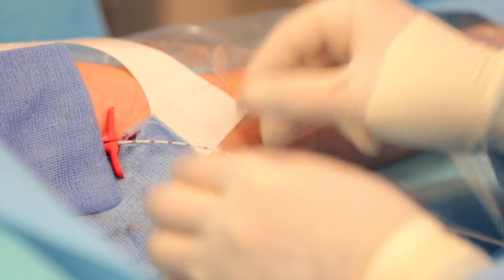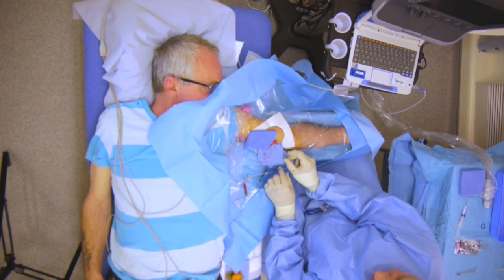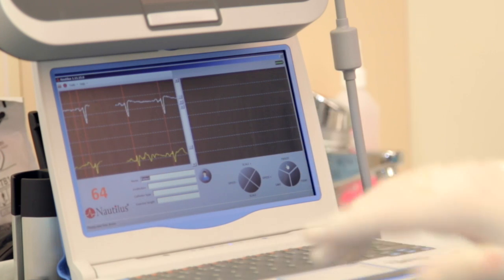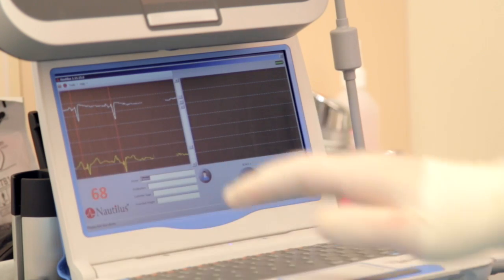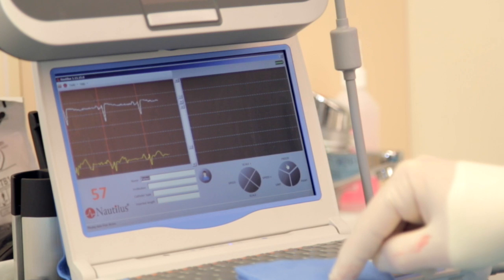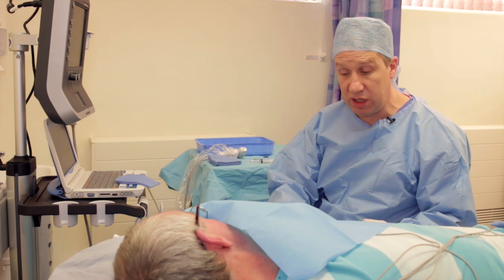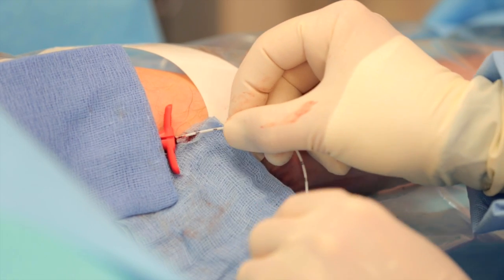The yellow intracavity ECG trace can wander if moved — it's very movement sensitive. Releasing the tourniquet and threading the line further toward central circulation. Having the patient look to the left with chin down on shoulder helps prevent the line from going up the internal jugular. Threading gradually and checking the ECG. Now getting toward the central system — the ECG starts to appear and doesn't look very different from the surface ECG, suggesting the system is working well but the tip is not yet near the myocardium.